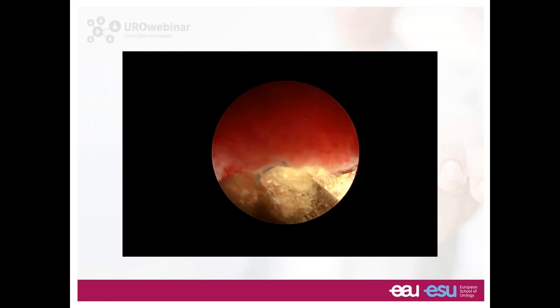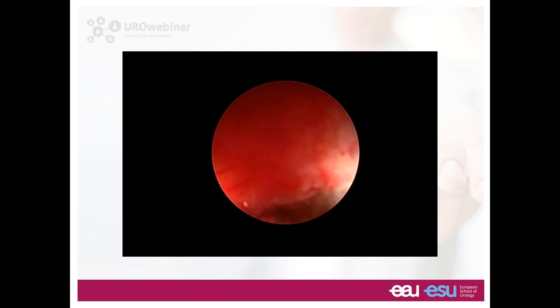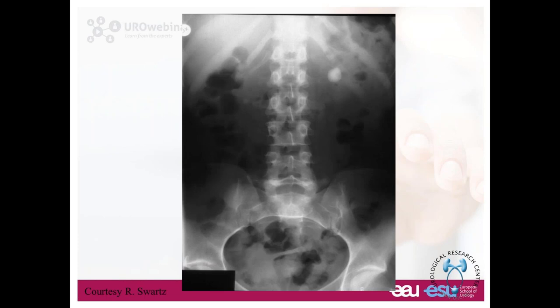You see a black thing on top of the stone — a foreign body inside the kidney. When you put a hydrophilic wire over an impacted stone, the impacted stone acts like a knife over the hydrophilic coating. Sometimes it tears the whole hydrophilic coating, which remains inside the kidney and you can see it. In this scenario, nothing happens — you just take it out.